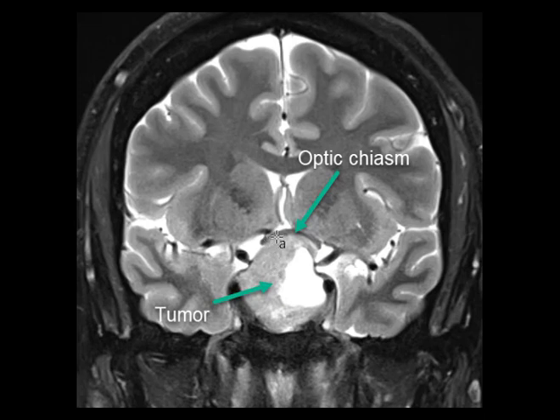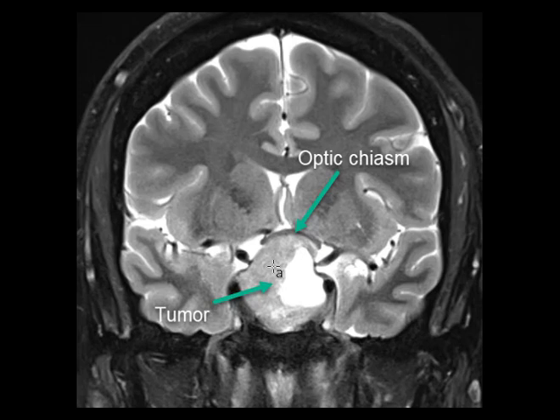See how the optic nerve and optic chiasm is draped over the tumor. Oftentimes also, the anterior cerebral artery will pulsate against the nerve on the other side, and the nerve gets pinned between the tumor and a traversing artery, and it leads to loss of vision, in particular peripheral vision.